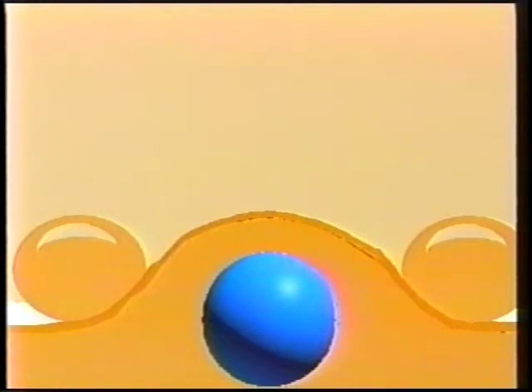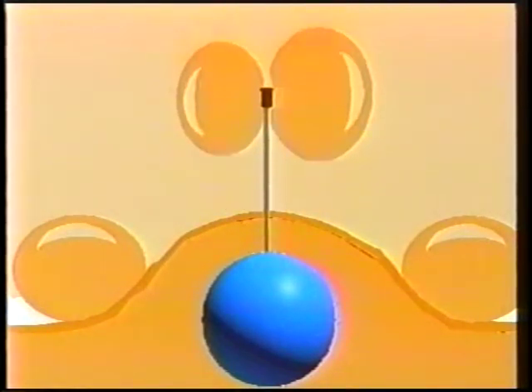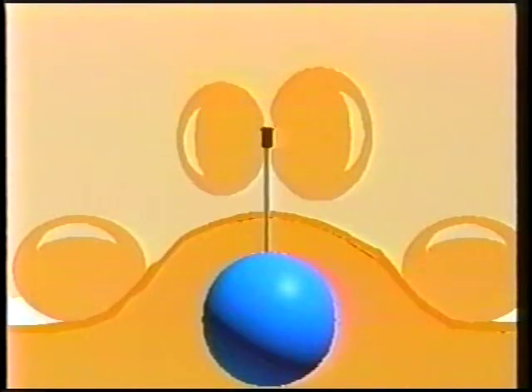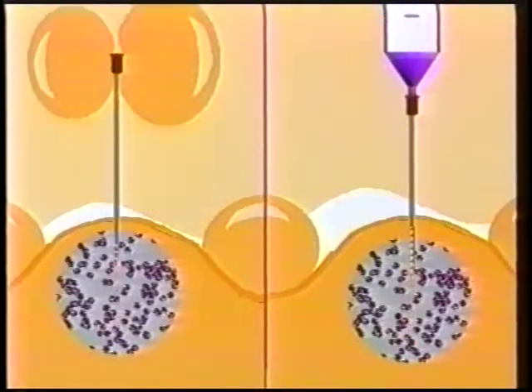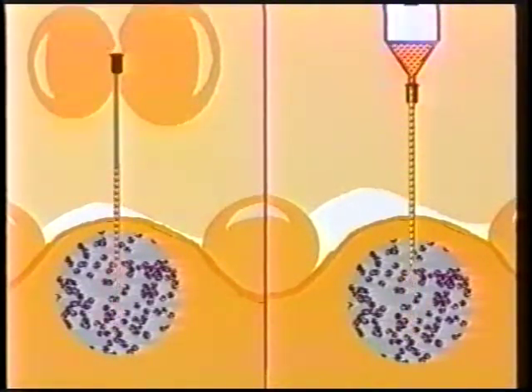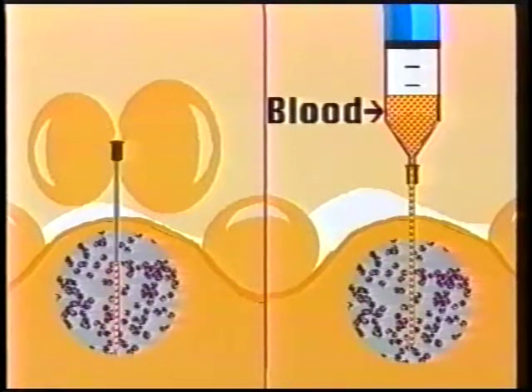With some practice, it is even possible to appreciate the brief resistance caused by the penetration of a thin capsule, such as that surrounding a lymph node. This difference in consistency, experienced as the needle penetrates, is harder to appreciate when using a syringe and the holder. A second advantage of using only the needle without suction is that there tends to be less admixture of blood when sampling highly vascularized targets.